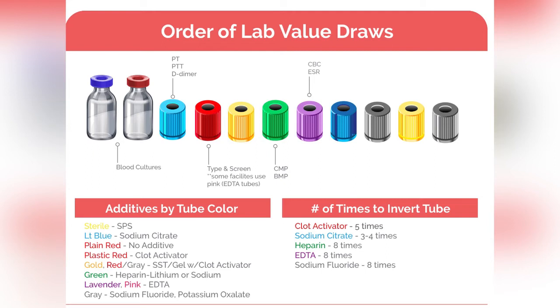Plasma separator tubes, PSTs, heparin tubes: green and gray rubber, or light green, plastic green. Heparin affects coagulation tests and interferes in collecting serum specimens. It causes the least interference in tests other than coagulation tests.